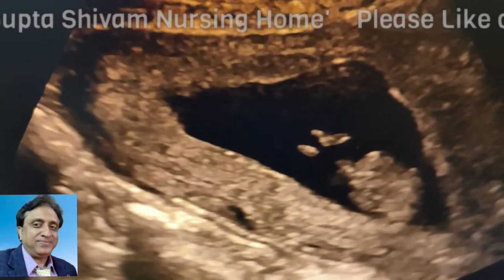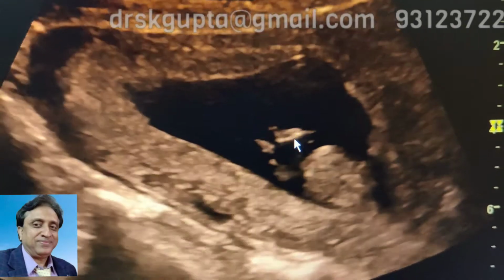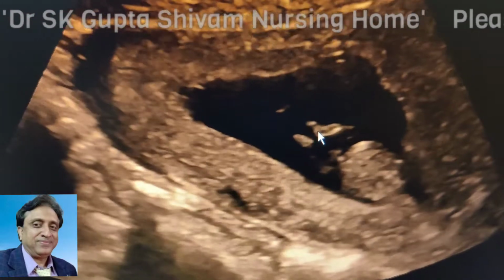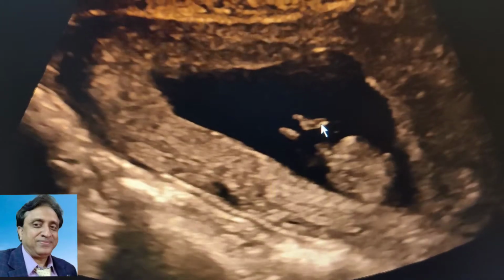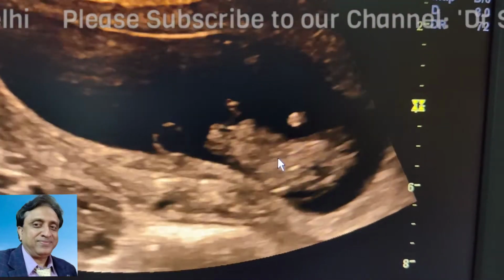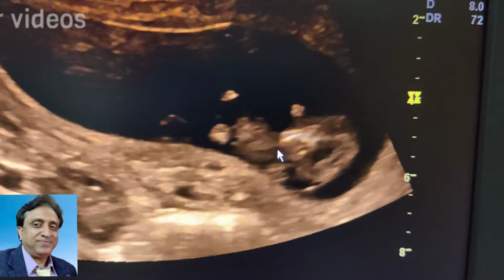After having seen the upper limbs, we should look for the lower limbs, and you can see that the lower limbs are well visualized, and these are both lower limbs. The femur, the tibia, fibula, and the feet are also visible, which are in the form of development. So this fetus has all 4 limbs visible at 11 weeks of gestation. To see whether the fetus is live or not, you can see that there is fetal cardiac activity which is normally seen. It suggests that the fetus is live, because in the first trimester, a live fetus is very important.